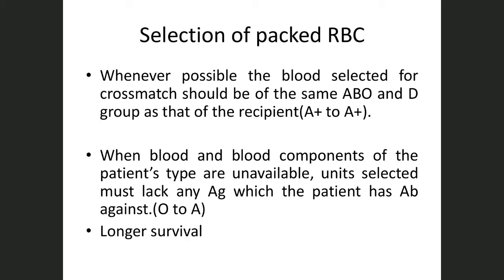Let's see now how to select. Some people argue for and some people argue against, and we will see what each group does when we discuss electronic cross matching. Usually we must do cross matching, whether serological or electronic, when we want to transfuse packed RBC.